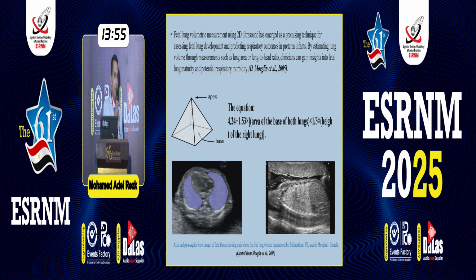In most advanced countries, the 3D and 4D machines, as Dr. El-Adi just illustrated before me, are now widespread. But we have to stick to the basics and know how to perform the fetal anomaly scan on a 2D basis, then upgrade our skills with 3D and 4D images and live scan for the baby.